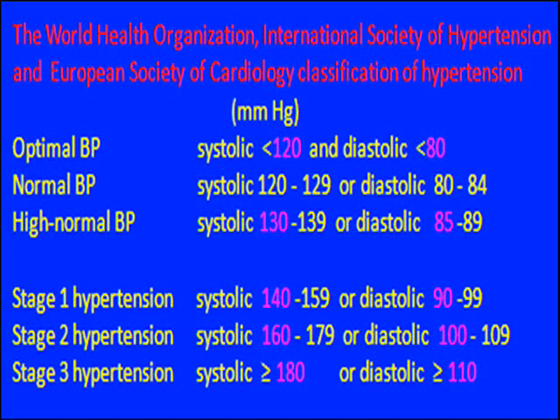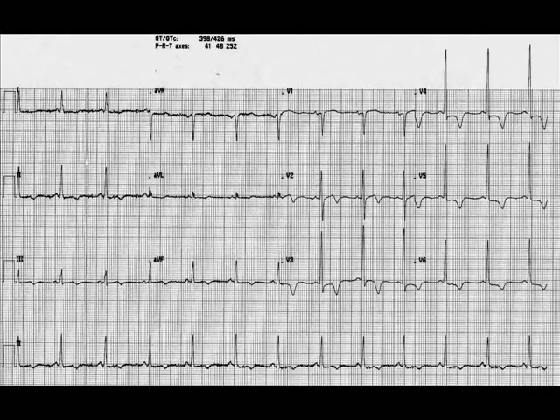The patient's ECG shows sinus rhythm and a normal frontal QRS axis, since the net QRS forces are positive in leads 1 and 2. A striking feature is the diffuse T-wave inversion in many leads. There is a deep T-wave inversion in leads V3 to V6, with a down-sloping ST segment in leads V4 to V6. The cause of T-wave inversion could be left ventricular hypertrophy or coronary artery disease.